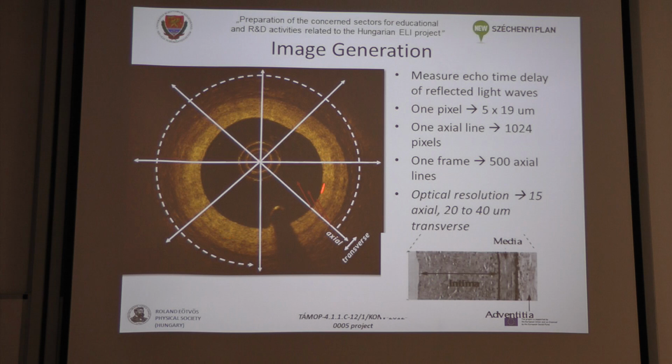macrophages in this luminal wall. And these macrophages are a certain type of white blood cells. Those are as big as 10 or 12 micrometers, and they can be identified one by one. And they are summing up all of them. This is really something where intensive research is going on. What is the clinical information they provide?